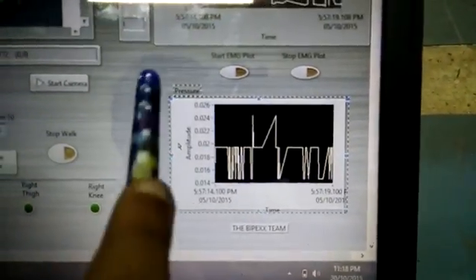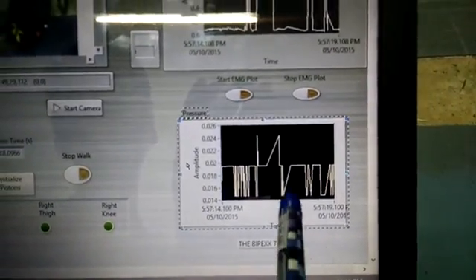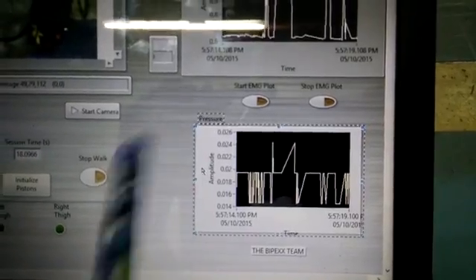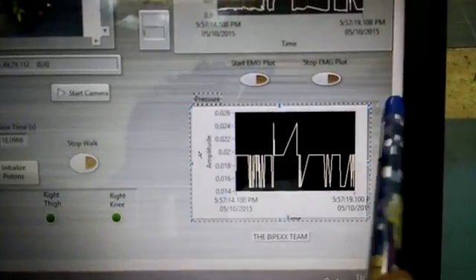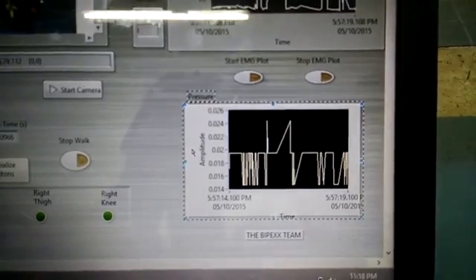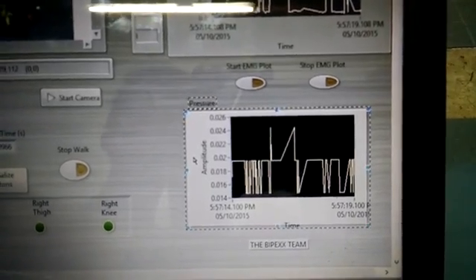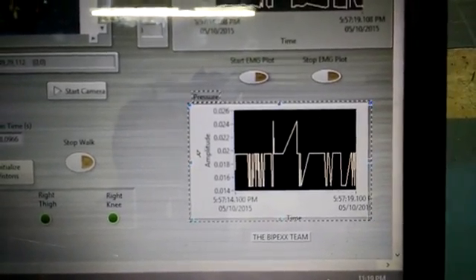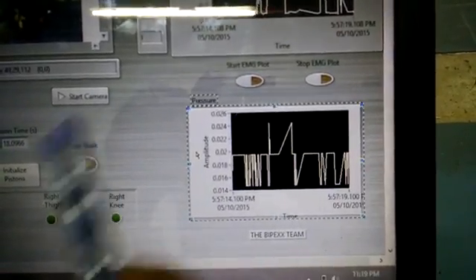Finally, this is the pressure waveform chart. Since we use air pressure in our biped exoskeleton for movement, we need to track the air pressure inside the exoskeleton. The pressure sensor installed on our biped gives a voltage difference according to pressure increase — as pressure increases, the voltage difference increases linearly. When the VI is started, we get a voltage plot corresponding to the pressure increase.